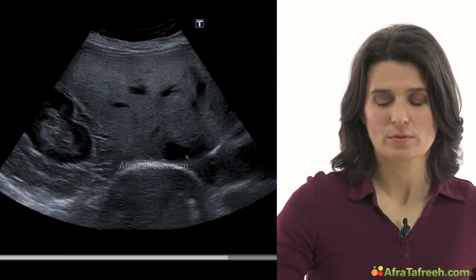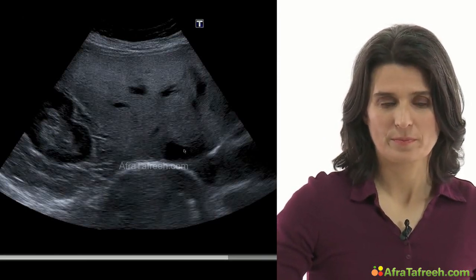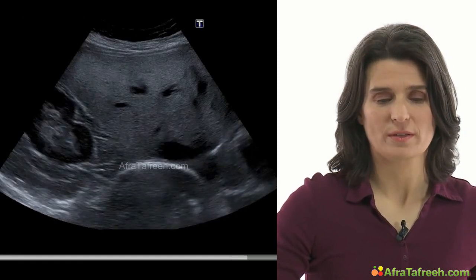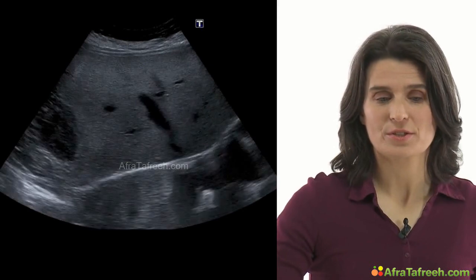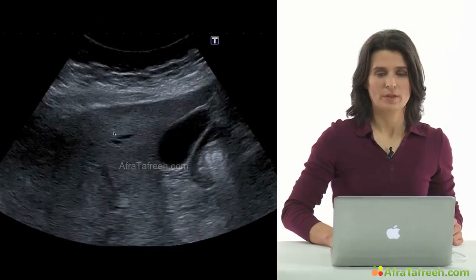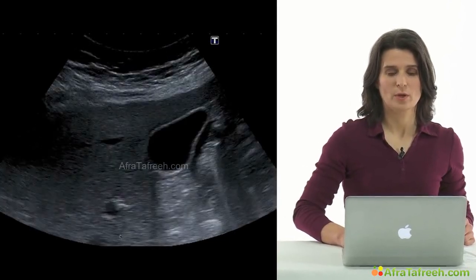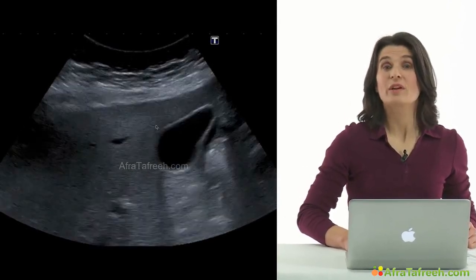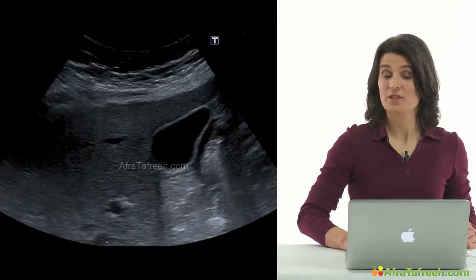And it also seems a little bit enlarged, the border is rounded. And this is also a sign, because a steatotic liver is enlarged too. Over here again, we got the liver, which is very bright, with a high reflexibility, high echogenicity.